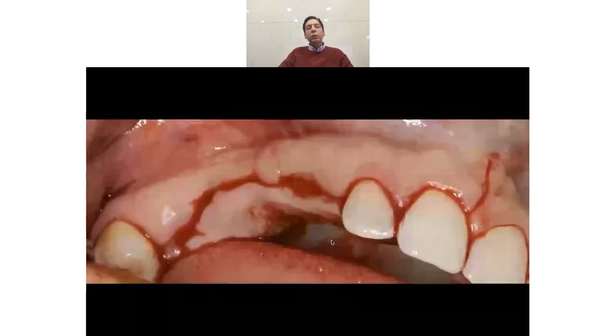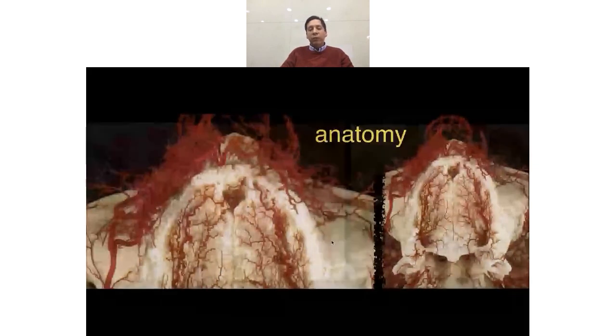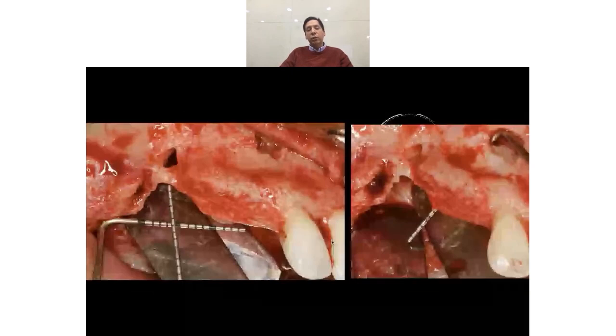So what I do always is a supracrestal incision. I know this approach is not too popular, but that's what I do. My rationale for my supracrestal incision is that the palatal flap will always be vascularized by the palatal arteries, and the buccal flap will always be vascularized, obviously, by the buccal arteries. So where both flaps meet, I do my incision. And I think that if I master the soft tissue management, I will have no exposure. We will speak, I think, in question and answer about that topic.